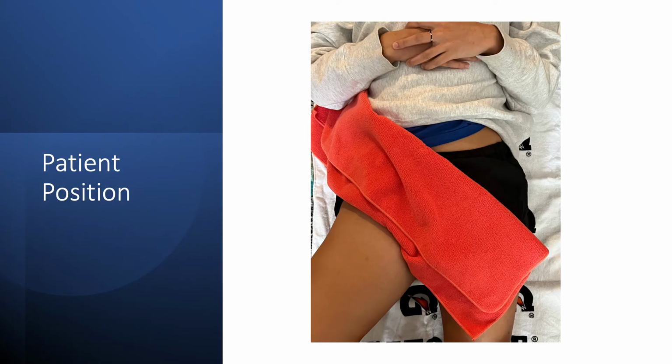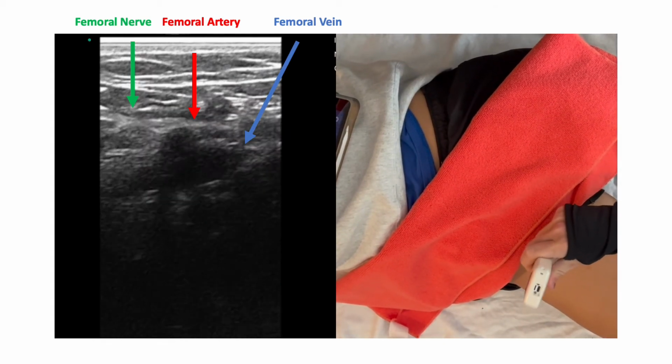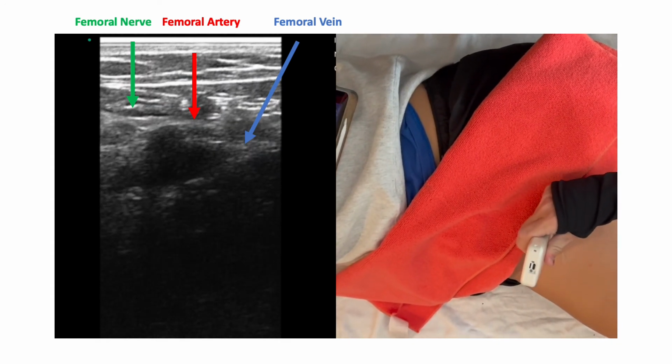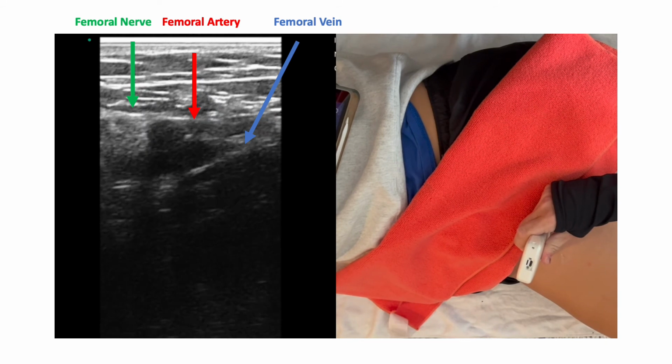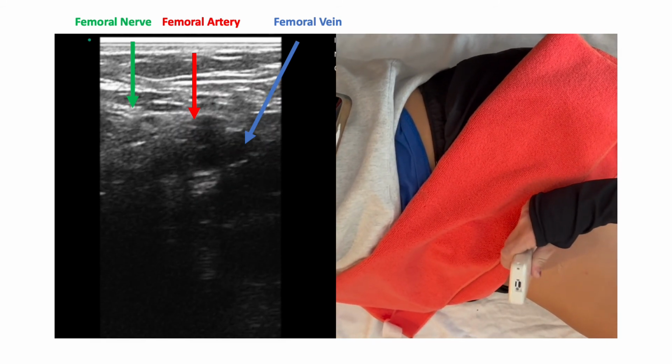When preparing a diagnostic ultrasound evaluation, the patient will lay supine with the hip externally rotated in a frog leg position. Once the patient is in this position, the skin should be exposed while appropriately draping the patient to maintain privacy. Once the patient is in position and appropriately draped, the examiner will prep the area with gel. The linear transducer will be positioned on a transverse axis, with the indicator on the left of the examiner to match the monitor screen orientation.